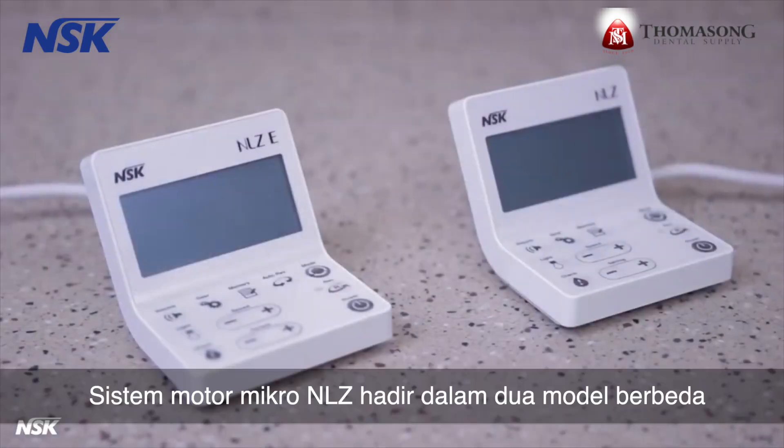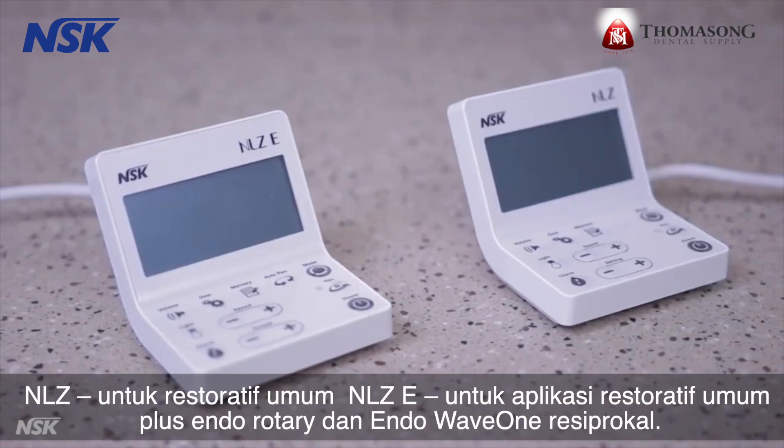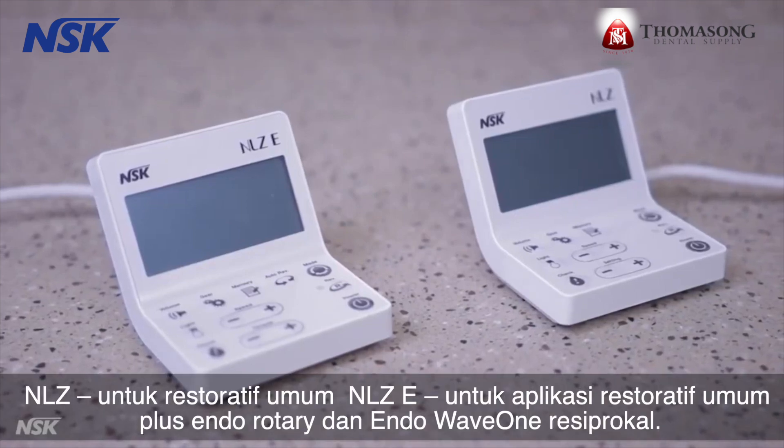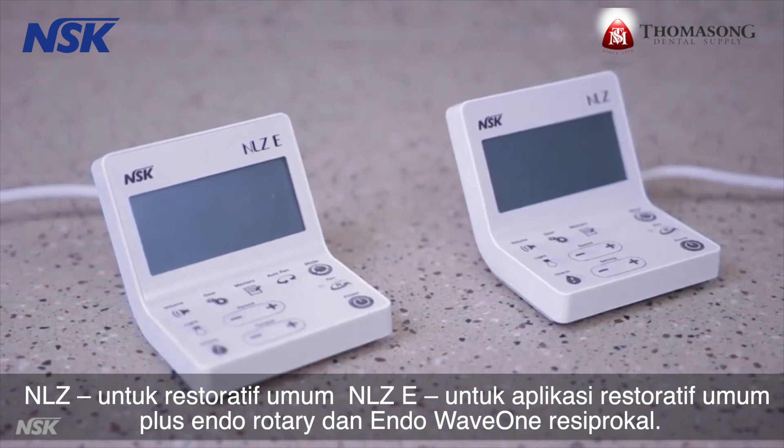The NLZ micromotor system comes in two different models: NLZ for general restorative, and NLZ-E for general restorative applications plus endo rotary and endo wave one reciprocal.